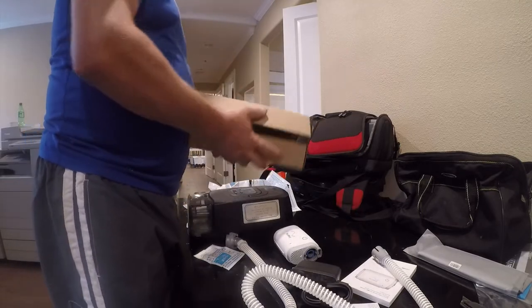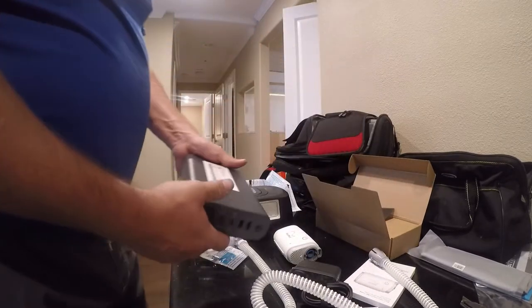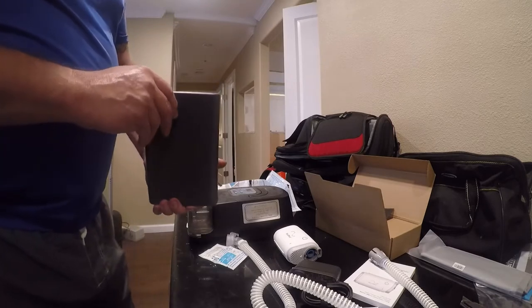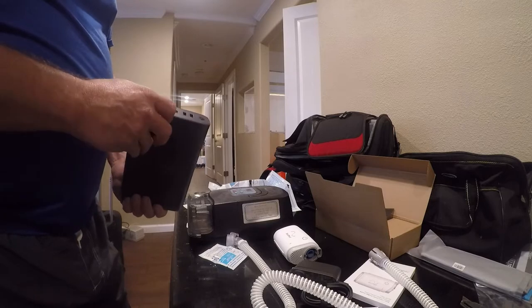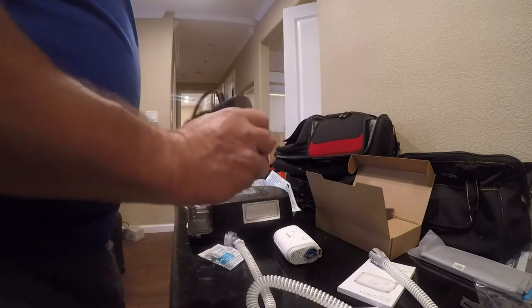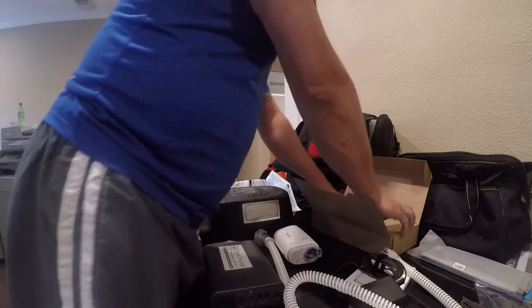I did buy a travel battery. Wow, this thing is huge. It weighs a good two pounds. But this is something I really needed in order to use my CPAP machine on the go. This will plug in here and then power my CPAP machine. It should have enough capacity for a couple nights, or if I'm on a plane and want to take a nap.